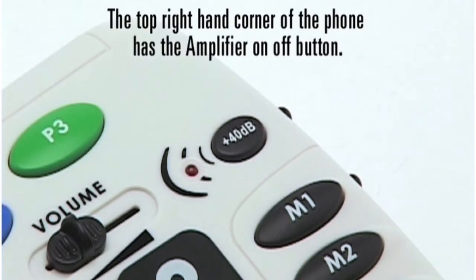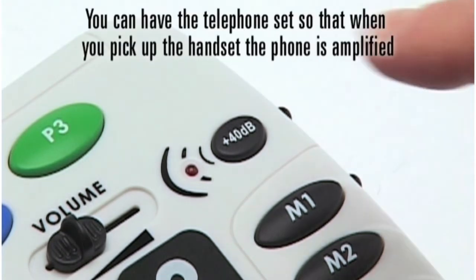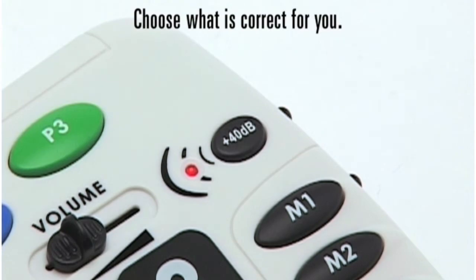The top right-hand corner of the phone has the amplifier on/off button. You can have the telephone set so that when you pick up the handset the phone is amplified, or you can have it set at regular volume. Choose what is correct for you.